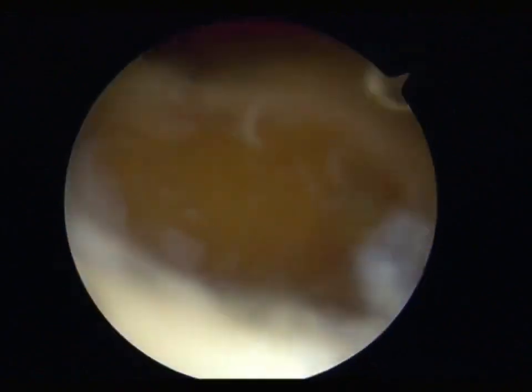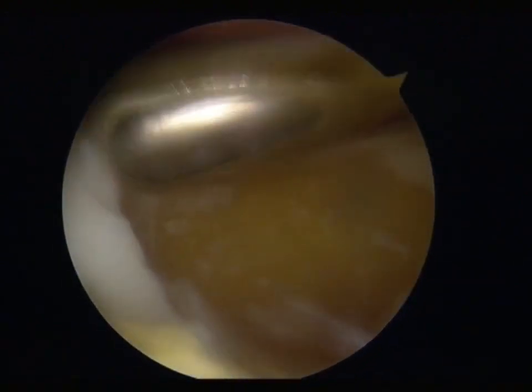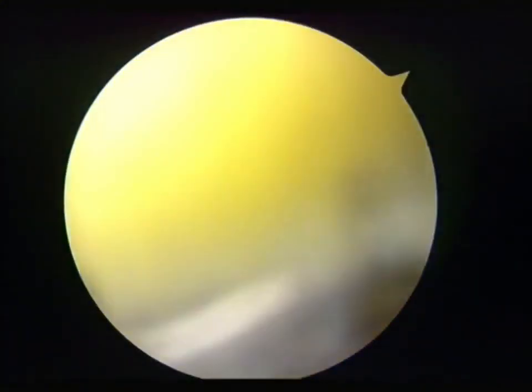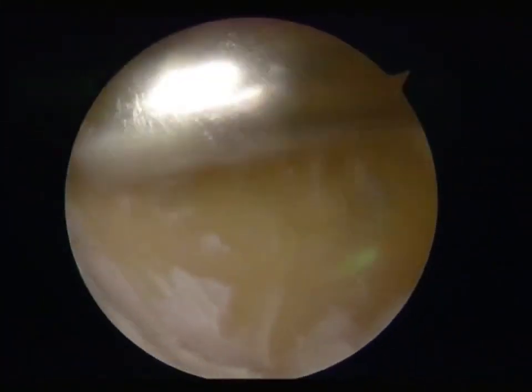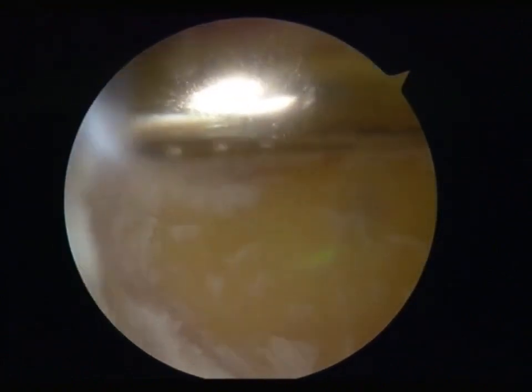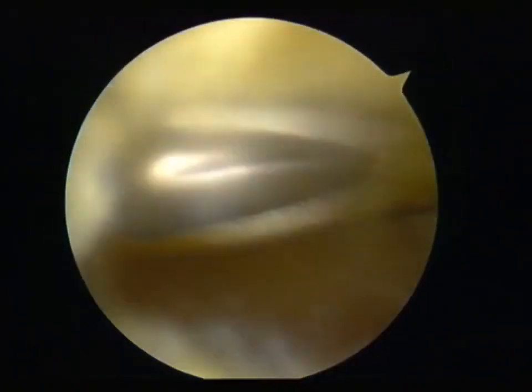Finally, use a shaver to remove the scraped debris and use a suction device connected to it to suction out the debris. The cleaned joint surface is shown in the video.